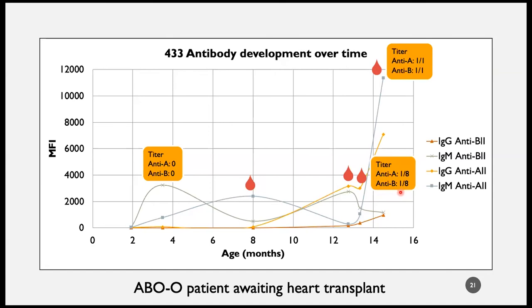So some possible explanations for these results could be non-subtype 2 antibodies, or even the high amounts of albumin that was administered that could drive agglutination here. These data highlight that when patients have a history of transfusion, the results need to be interpreted with caution.